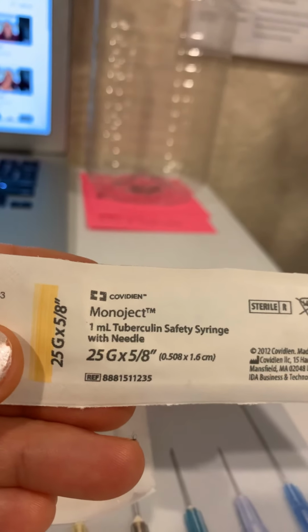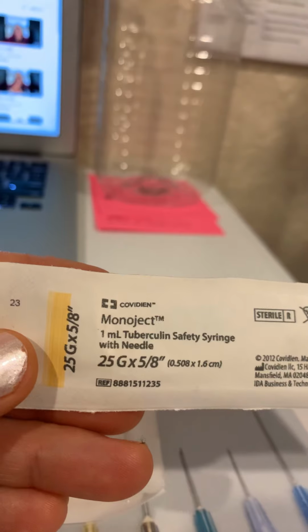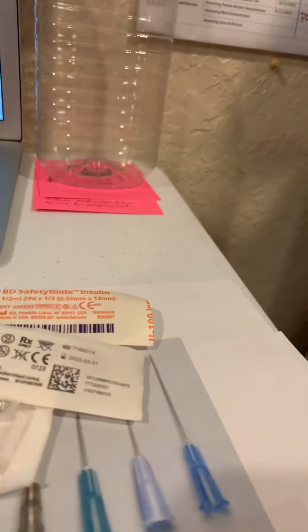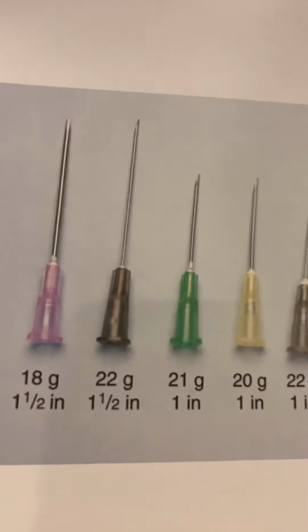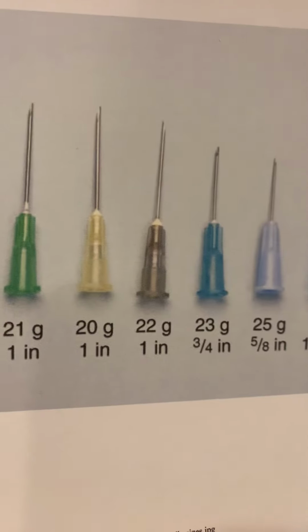So the finer the needle, it's meant more for sub-Q, like at 25, 29 is more for a sub-Q or intradermal. And as you get a little bit wider, so for your IM injections, I would say anywhere between a 22, you could even do 25, but 25s tend to get a little flimsy.